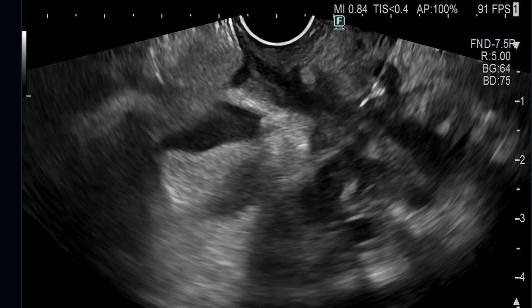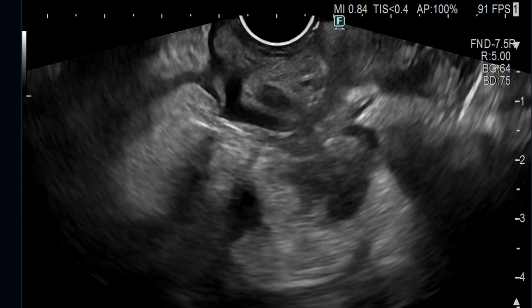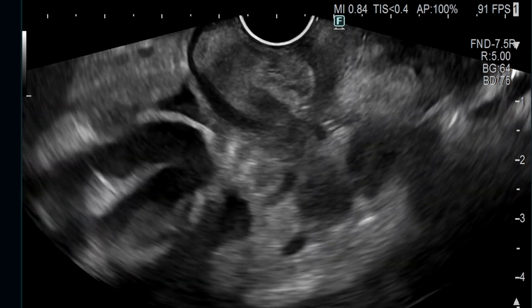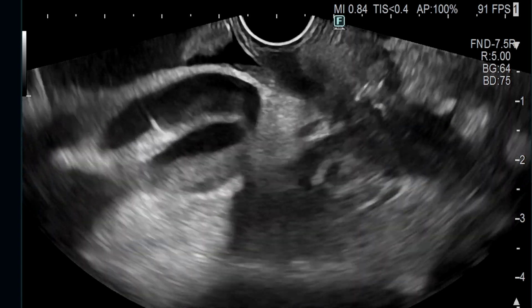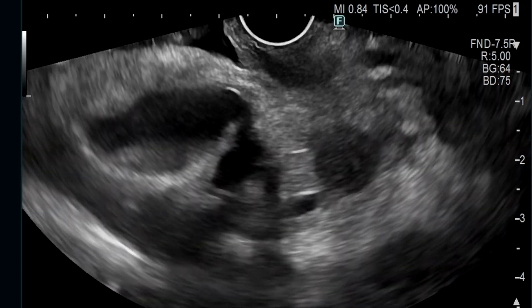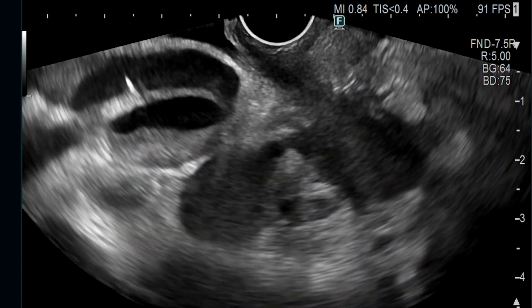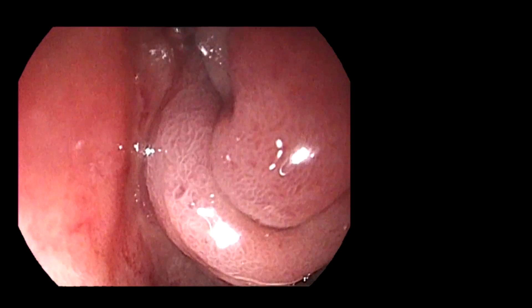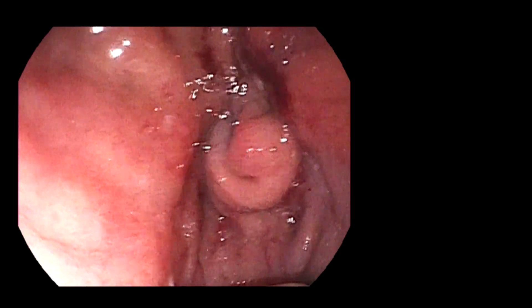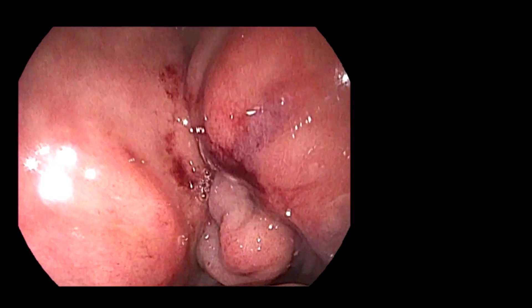This resulted in a malignant distal biliary stricture and an almost complete obstruction of the second portion of the duodenum that precluded access to the major papilla for biliary stent placement. Therefore, a decision was made to perform an EUS-guided choledochoduodenostomy for the malignant biliary obstruction and an EUS-guided gastrojejunostomy for the malignant gastric outlet obstruction in the same session.